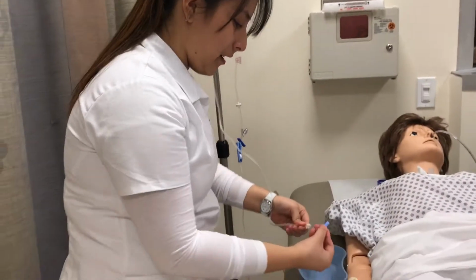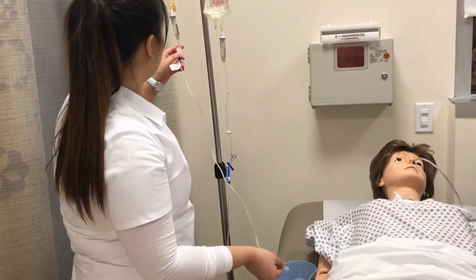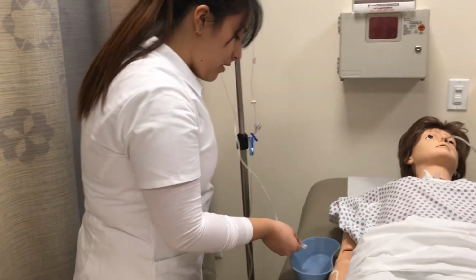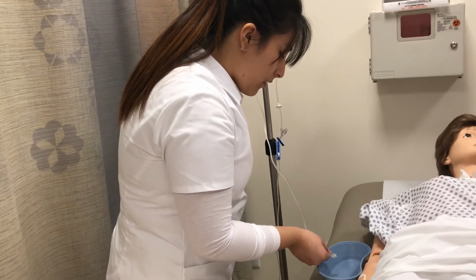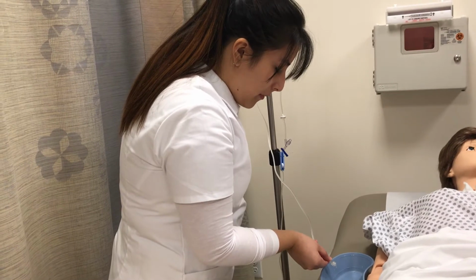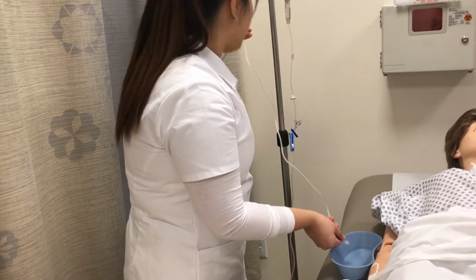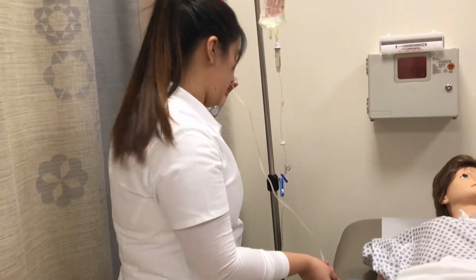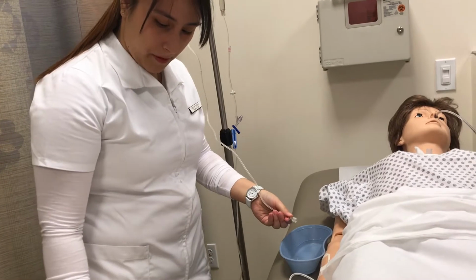Since I won't be recapping, I have to keep sterility. And place it. And slowly prime, checking for air bubbles, and only a little to prevent wasting medication. Okay, so it's good. No air bubbles. Okay, and I'll be recapping.